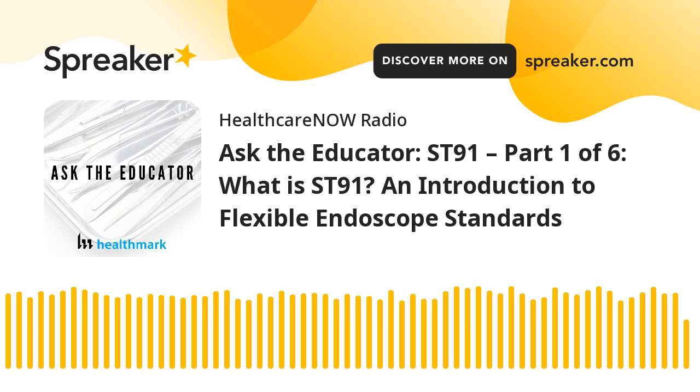When you're doing your crosswalk to see if you're in line with ST91, if something is a shall and you're not doing anything on that topic, you really should be doing something. So that would be your next priority. And it really does help with that prioritization because you'll see in this series of podcasts that there's a ton of changes, many new requirements, and it is going to take time to implement those. So really paying attention to those words will help prioritize what your next steps are.